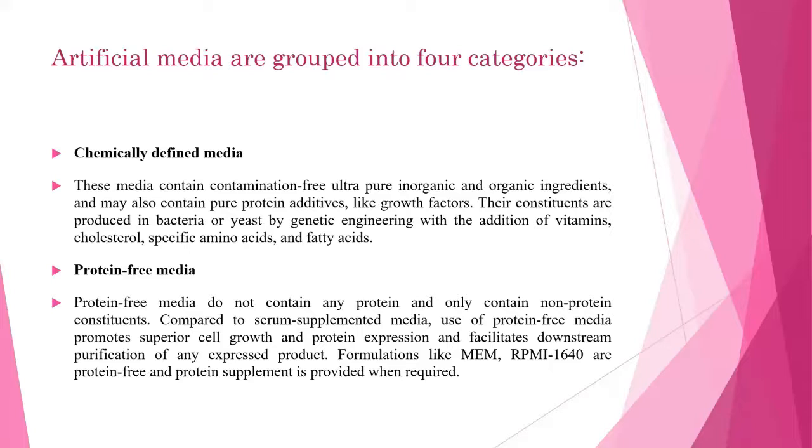Yes, the next type of media is a protein-free media. Okay, this is in case you are culturing a specific cell type again. So protein-free media do not contain any protein and only contain non-protein constituents. So unless and until you need such a type of cell, and you have to grow a cell which is not compatible to the proteins, only then you will have to culture it using the protein-free media. So compared to serum supplemented media, use of protein-free media promotes superior cell growth and protein expression and facilitates downstream purification of expressed product.